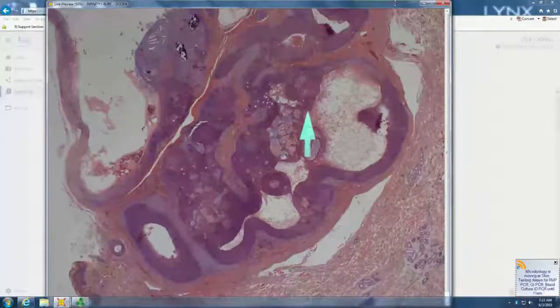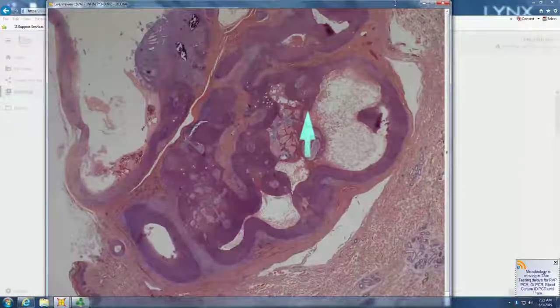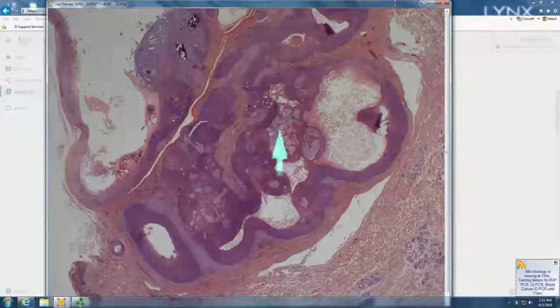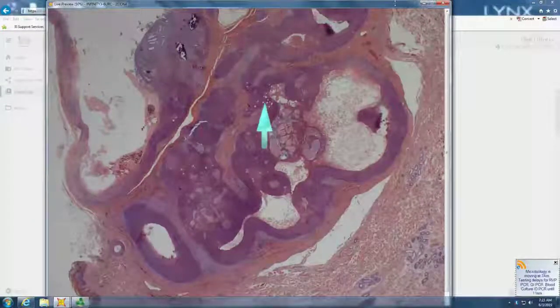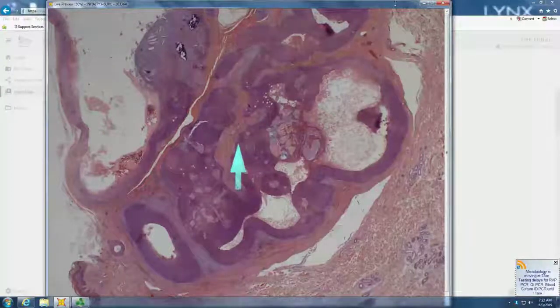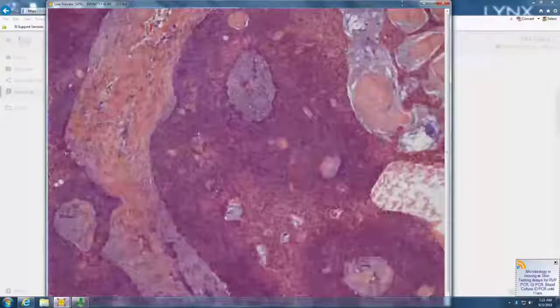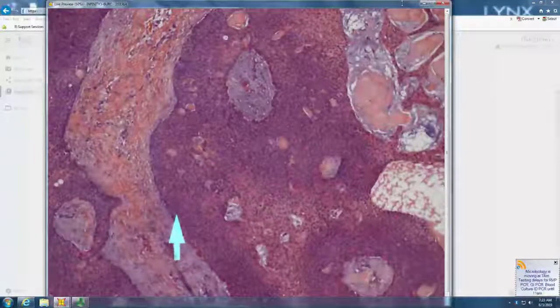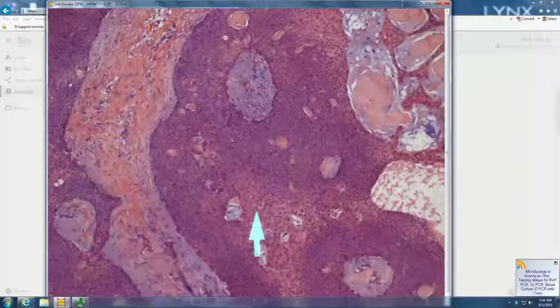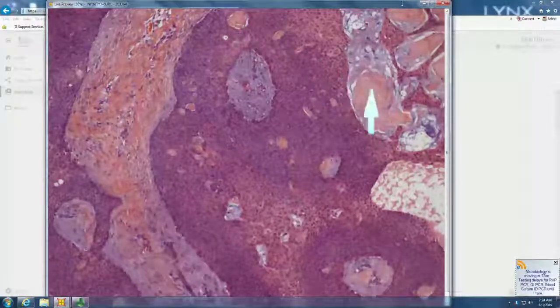So it looks like fluid-filled areas. Fluid-filled areas, so it's a sweaty tumor, very sweaty, right? And what are these little clear round things? Ducts. So they're ducts. Does it palisade or no palisade? It looks like it palisades. Let's go higher. Oh no, it doesn't palisade. No palisade. So this is something that distinctly has no palisade, has visible cytoplasm, has ducts, and has this curious osteoid-like stroma.